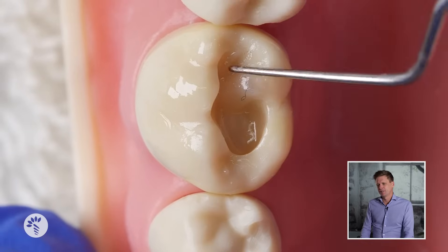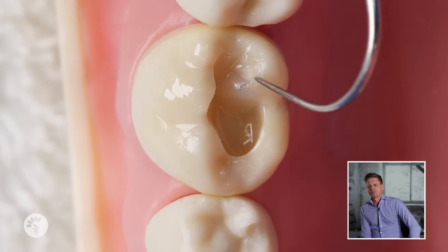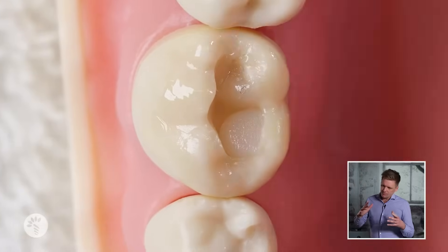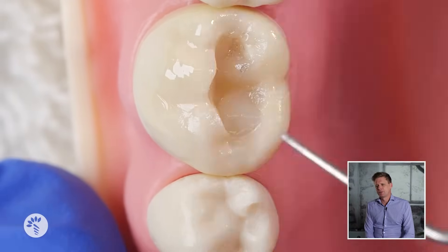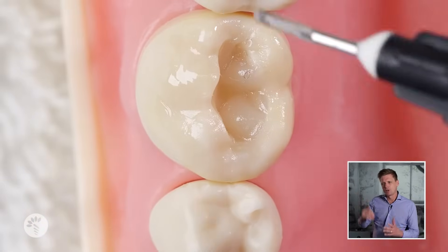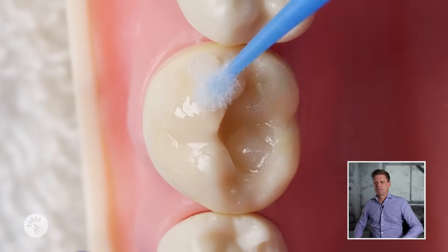Yes, there's a tiny piece of hair off the micro brush — you get these in your fillings too, you just can't normally see them because this is massively magnified. We get the basic shape of cusps with the micro brush and then use the tip of the probe, but the probe is leaning on the inclines of the existing cusp — that's how you get the shape right. You're using the probe sitting against the existing cusp.